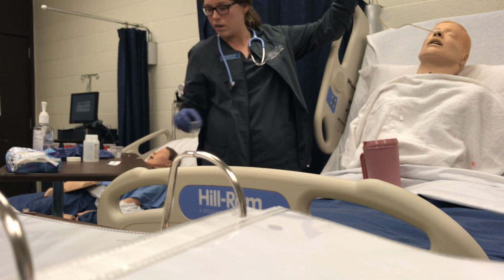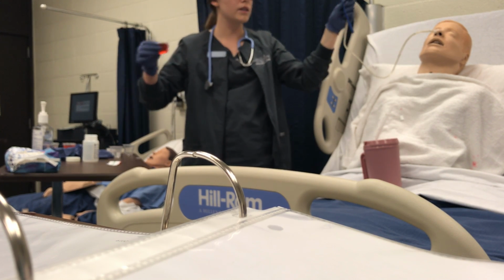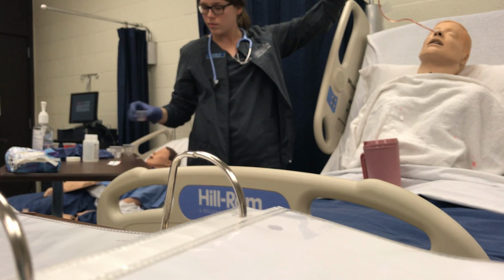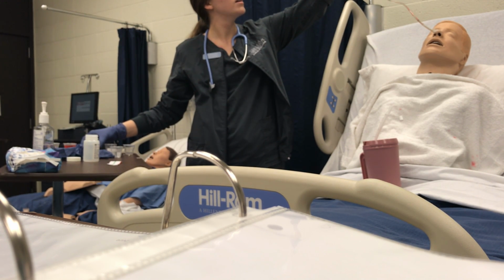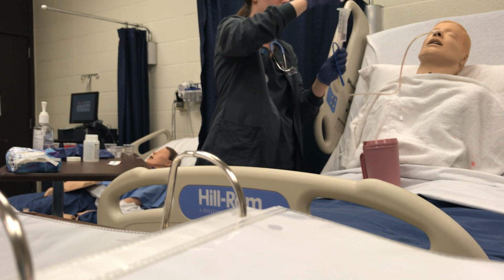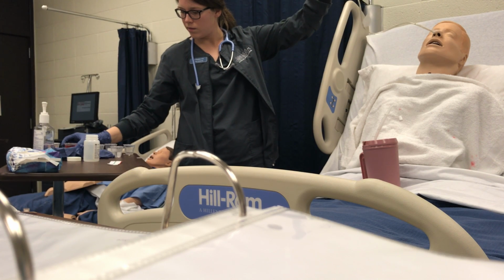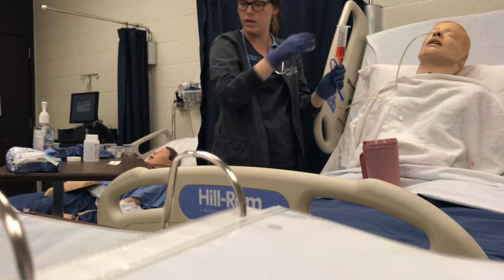I would let that drain. And I would go ahead and administer my first medication, again using gravity to help that go down. All right. Then I would flush that one again with another 10 to 30 mils, just to make sure we aren't mixing medications. All right, very good. Do my next med.